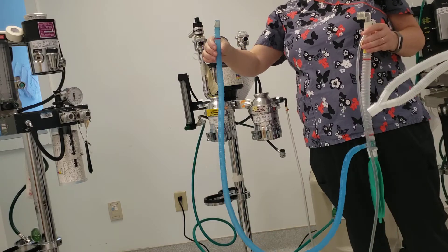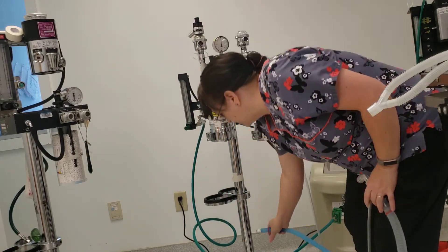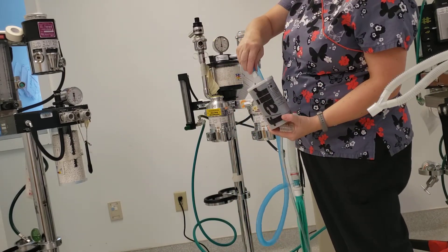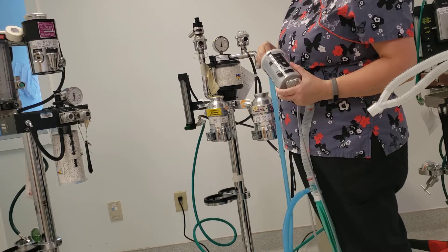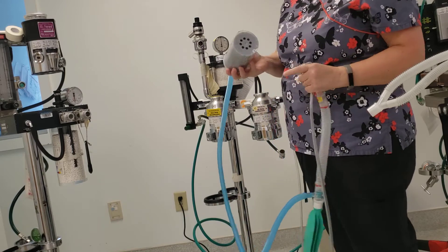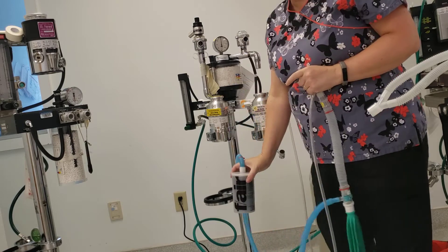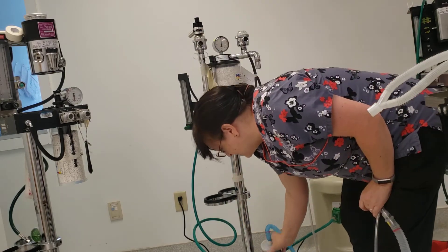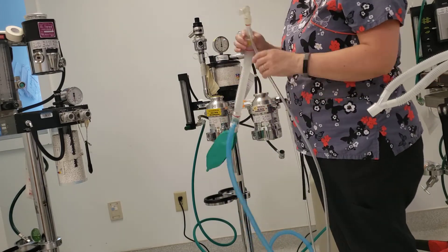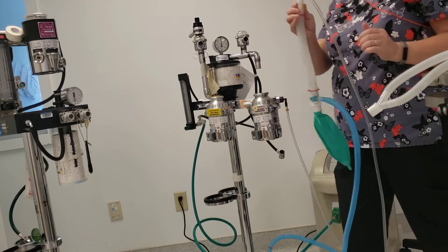You have a scavenger line, so it needs to be hooked up to your scavenger system. In this case, we have an F-air canister, which looks like this, and it goes right into the port here. This needs to stay above the ground — you can't just set it on the ground. There are little wraps on the anesthetic machines to keep them up so that the air can circulate out of them. Now our non-rebreather is hooked up so that we can hook it up to a patient.